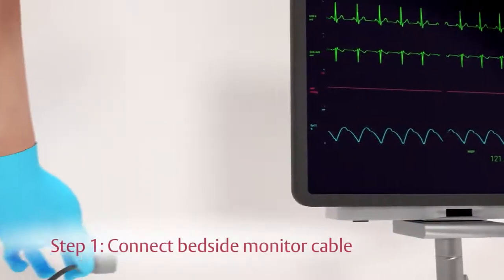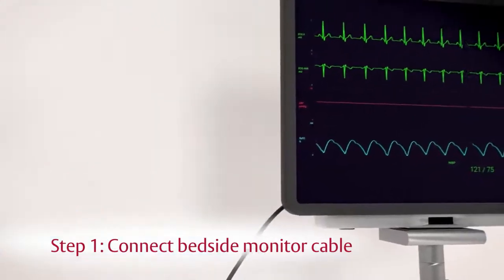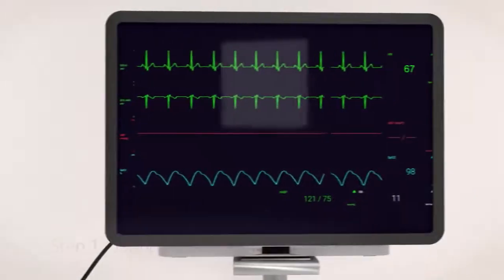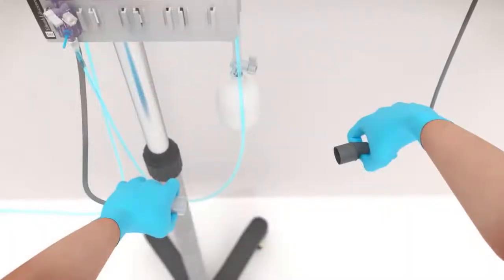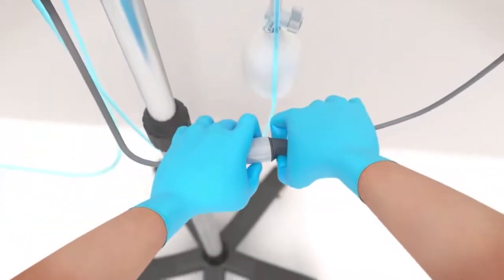Step 1. Connect the appropriate TruWave reusable pressure cable to the proper port on the bedside monitor. Then connect the opposite end of the reusable cable to the TruWave transducer's white connecting cable.